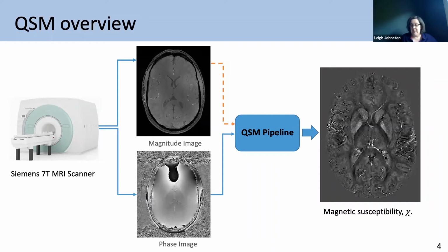And at that point, if we're able to take our phase images and use our magnitude images in a smart way to come up with estimates of the magnetic susceptibility, then we say that we have imaged iron plus a whole bunch of other things, okay? So this is really the kind of thing that you present these images to people studying neurodegeneration, and I have no idea if there are people on the call that fall into this camp, but you can certainly question me about it later.